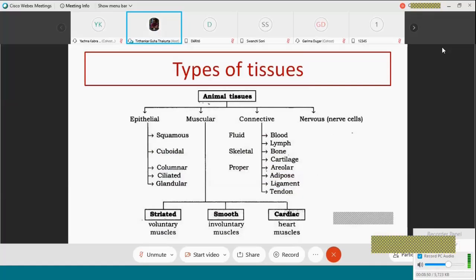So, what we are trying to say here is that whichever organ in the body you are talking about or studying under the microscope, essentially it's an amalgamation, an organized presentation of these components. Except for some special modification of this tissue, we do not find more varieties in our body. It's a permutation and combination of these simple components that make every tissue and organ look as it is and function as it is. So before we start with identification of organs, let us quickly see if we remember how the fundamental tissues look.